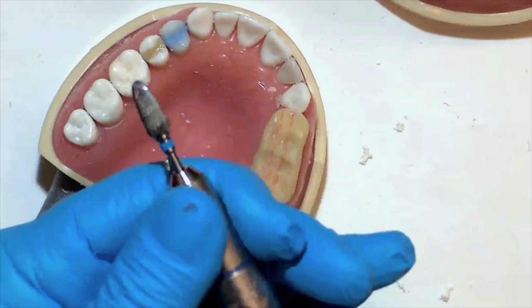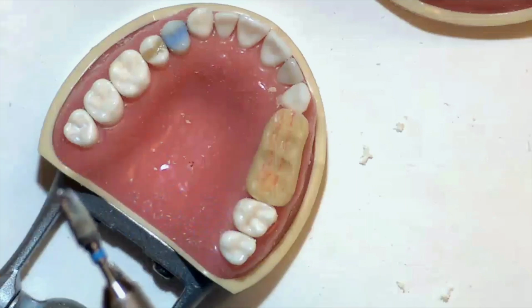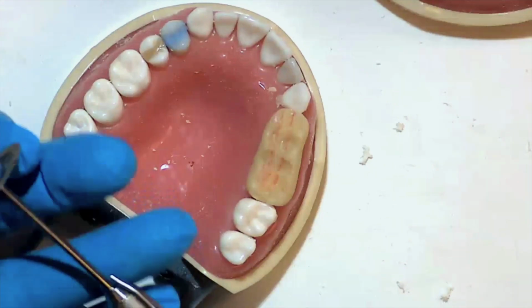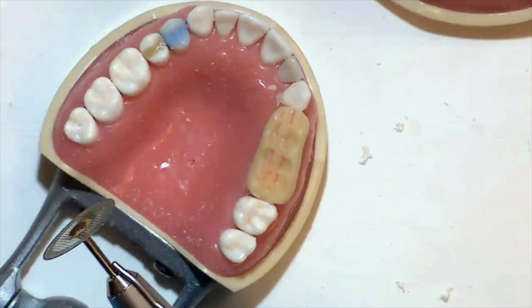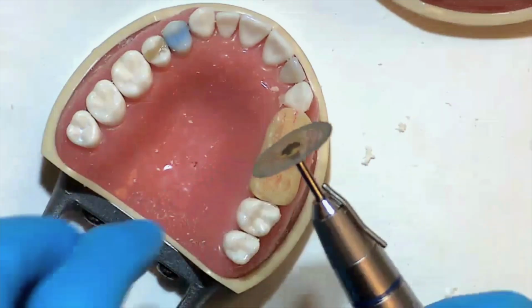And we're going to change instrumentation here and put on our diamond wheel. Doesn't have to be a diamond wheel, but I happen to like it because it's flexible and is good for doing the embrasures. You can use any kind of cutting disc for this.